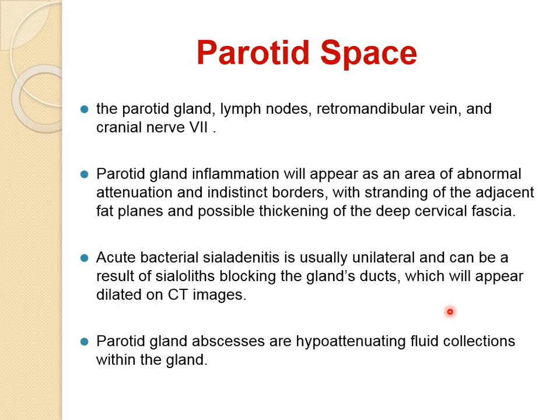We see it daily as an area of abnormal attenuation and indistinct borders, with possible thickening of the deep cervical fascia. Mostly it's acute bacterial sialadenitis, unilateral, or a stone blocking the gland duct, which will appear dilated on CT images. Parotid gland abscess can be seen as a hypoattenuated fluid collection within the gland.